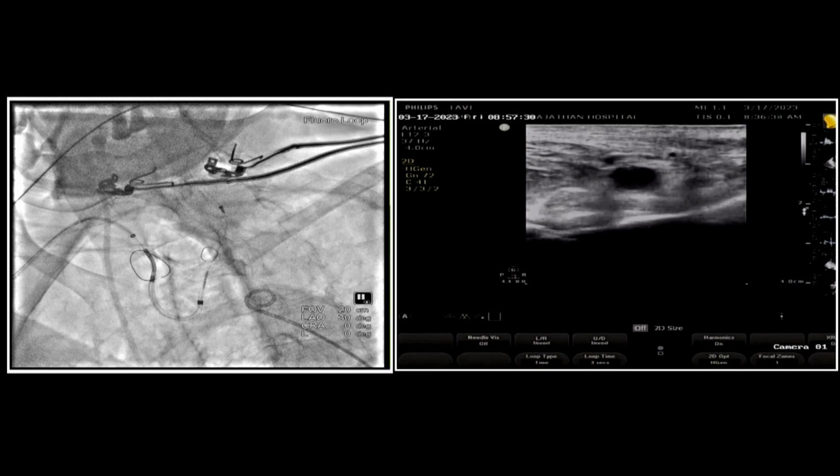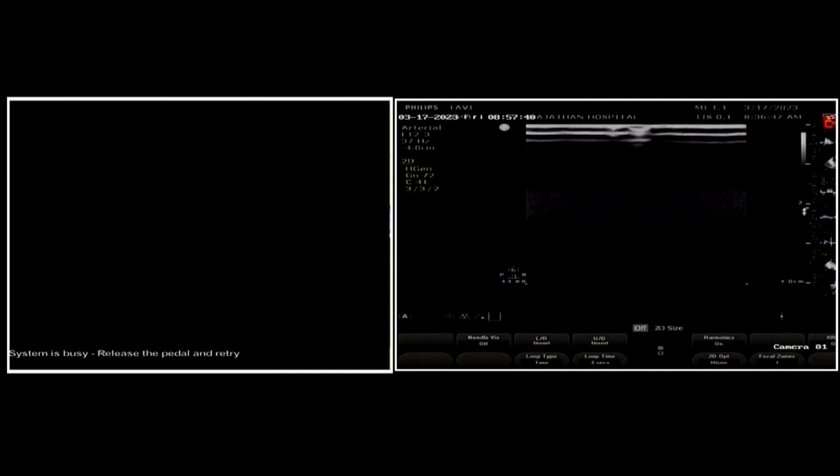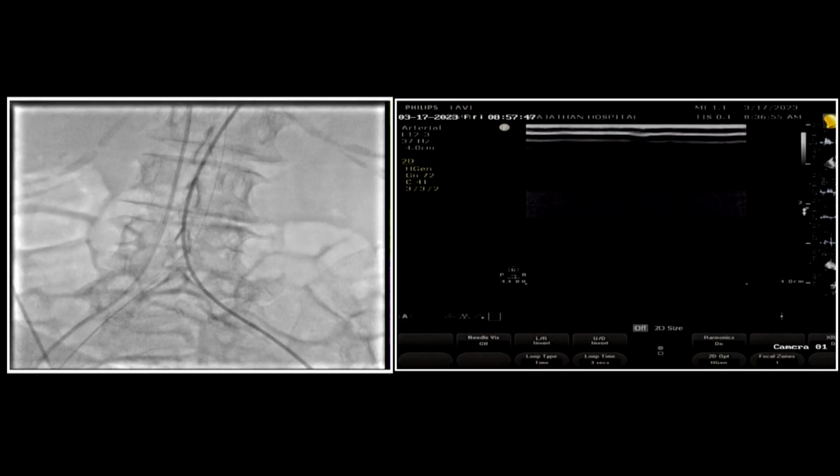So for the audience, the Octacor is, of course, a domestic design. It's just 2 rows of cells. Okay, so we did an ultrasound guide here. Can we see down, please? With a minimal shortening. Okay, so this is by micropuncture. Implantation. So minimal shortening of 19 to 21%.